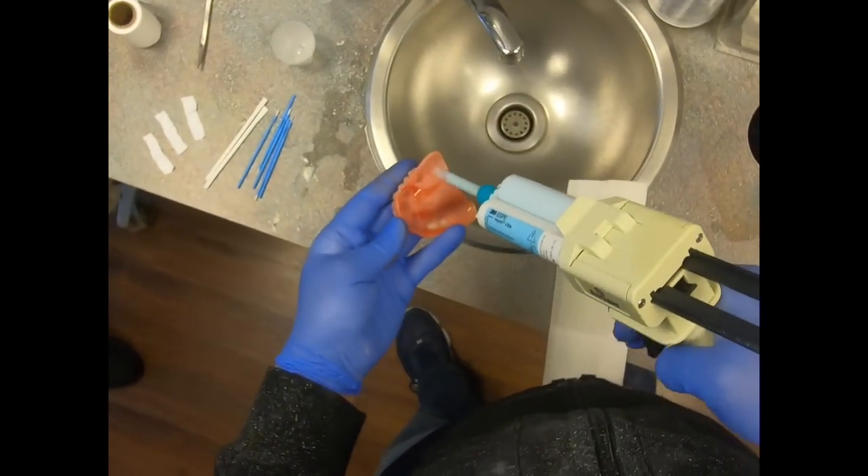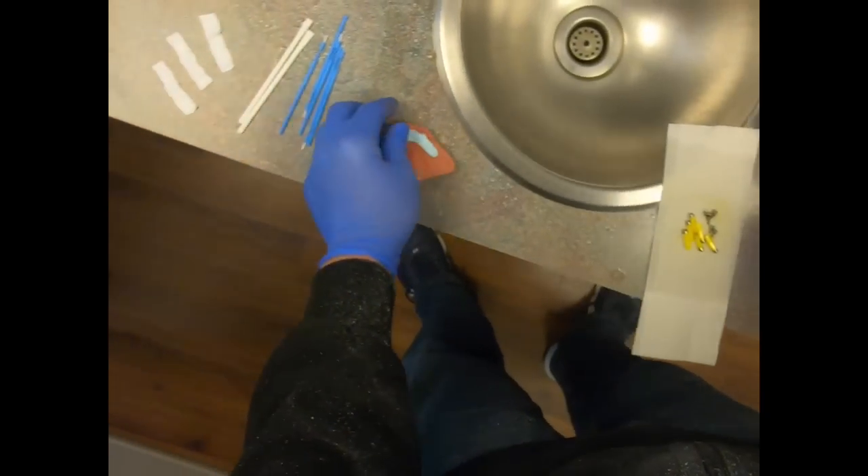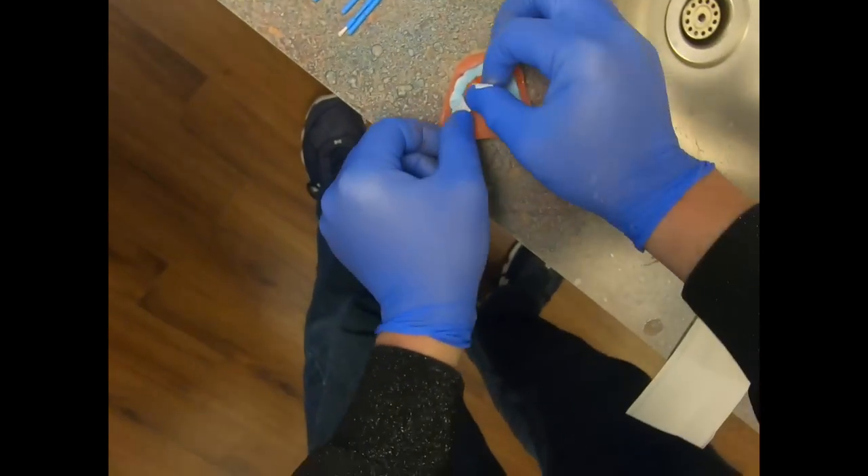we inject bite registration material into the denture, and then we'll cover that bite registration material with Teflon tape. The Teflon tape has two main advantages.